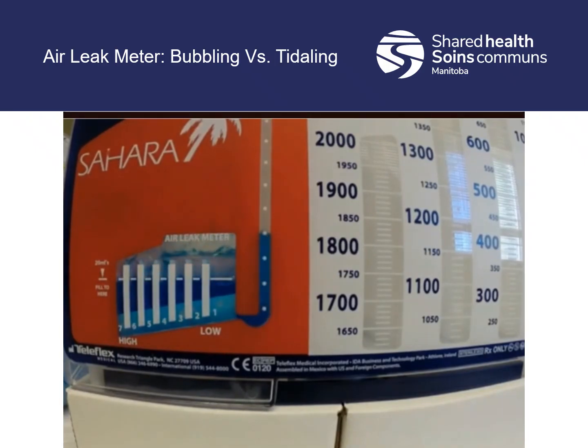we can see this going in. Okay, so you can tell there's a pattern to it. When they're breathing, it rises with inhalation, it falls with exhalation, it goes back and forth. When you're seeing that, that's tidaling. That's not a sign of a leak. That means that it's working appropriately, because obviously there's a change in pressure inside the thoracic cavity, and it's reflecting that on your seal chamber.